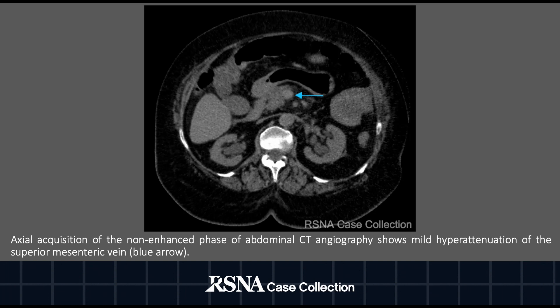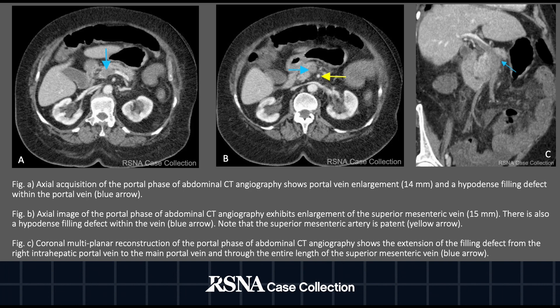The axial acquisition of the non-enhanced phase of the abdominal CTA shows mild hyperattenuation of the superior mesenteric vein. Figure A, an axial acquisition of the portal phase, shows portal vein enlargement with a hypodense filling defect within the portal vein. Figure B, an axial image of the portal phase, exhibits enlargement of the superior mesenteric vein with a hypodense filling defect. Note that the superior mesenteric artery is patent, as shown with the yellow arrow.